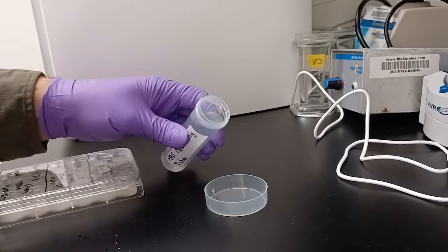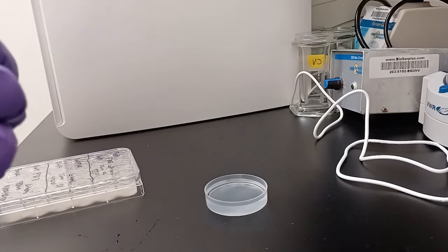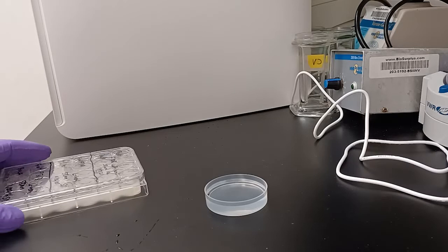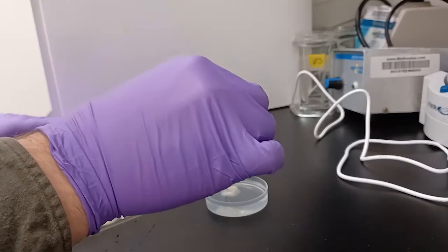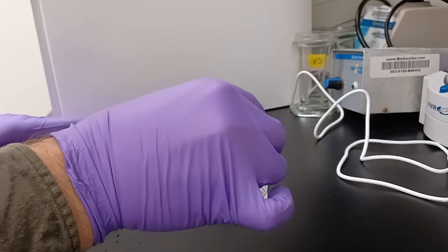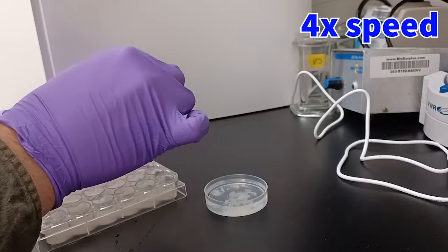Pour 1x PBS into the basin. Uncover your stored sections in PBS plus azide, or otherwise cryoprotectant, and retrieve the sections in clumps. Here you can see I'm reaching in with a bent paperclip to pull them out, much like hanging them on the end of the bent paperclip tip.